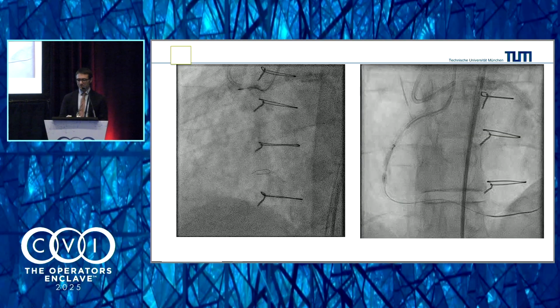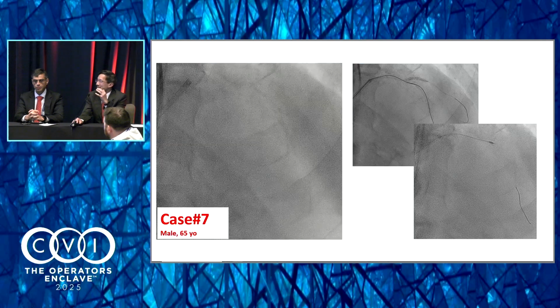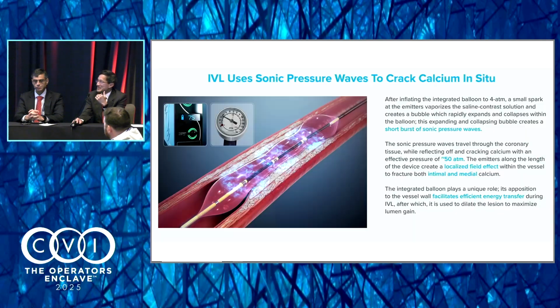Just try that. So I'm hearing undersized balloon, slow inflation, check every 5 atmospheres if you're going above a certain pressure. I see a lot of people's eyes bugging out. Us Americans, we're very fearful of malpractice. Well, how do you reassure us that going up to 45, even 50, will be safe? And what do you tell us Americans?